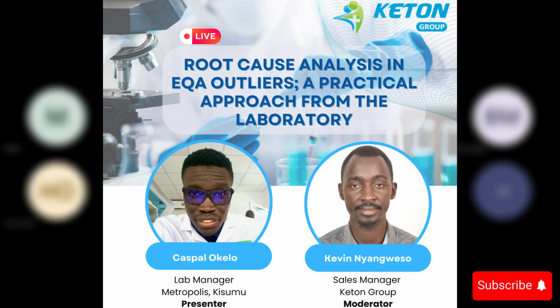To conclude your root cause, you'll need to check your QC results immediately before and after. If you still have the sample, you repeat the testing, then compare the magnitude of the deviation, and then review the QC process and the reconstitution process carefully. If the QC was stable, with no drift and no recurrence, it was one isolated failure, most likely random and or a sample handling variation.